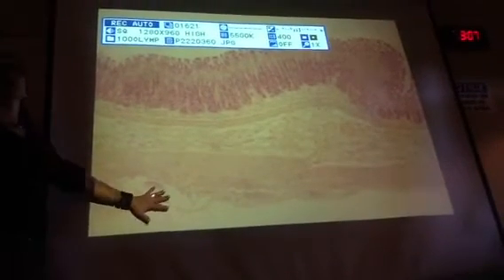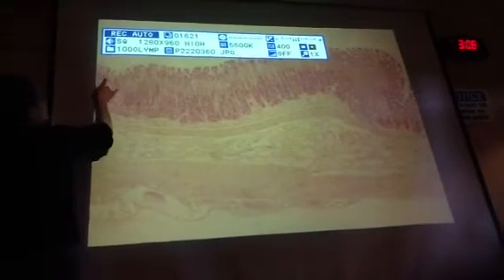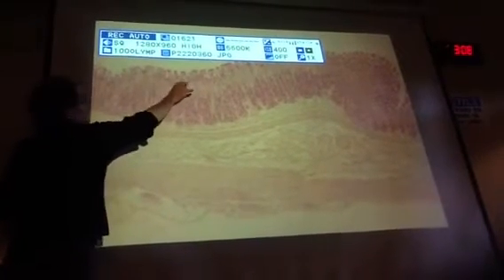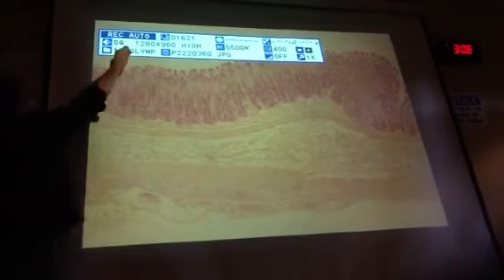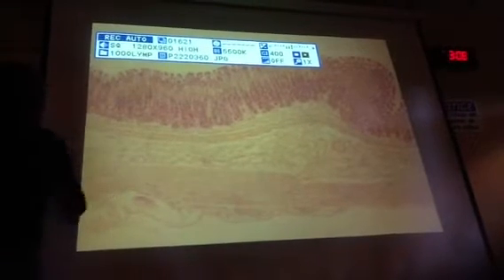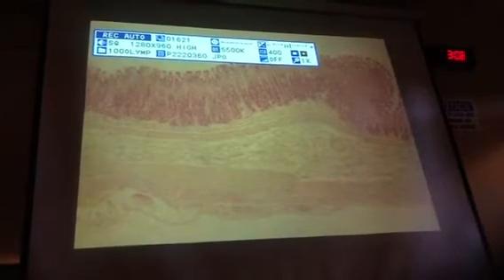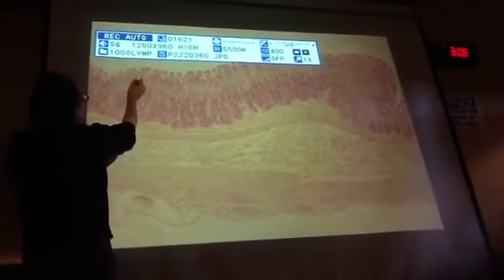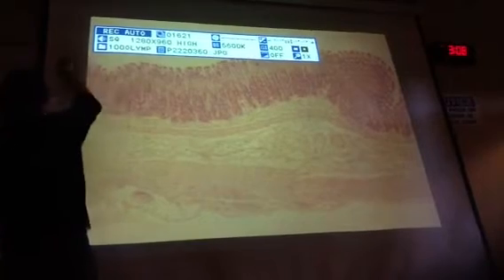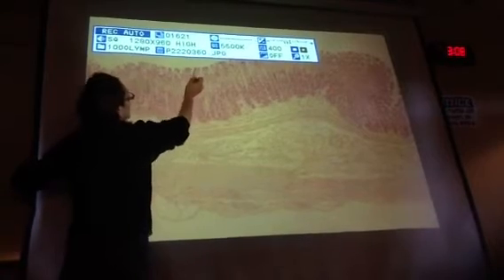This is the serosa. This is that dense connective tissue, lots of protein fibers. Over here, you can see that you can kind of follow a dark staining kind of squiggly area up here. That's your epithelia. So this is the lumen up here, and these are pits that you're looking at. So this would be simple columnar epithelia going around in these pits. So the simple columnar epithelia going around, and so these are the pits. This would be the lumen, and then it's pit, pit, pit, pit, pit, pit.